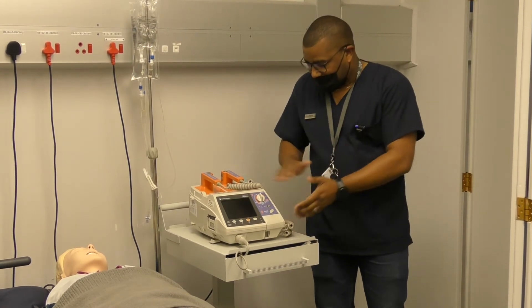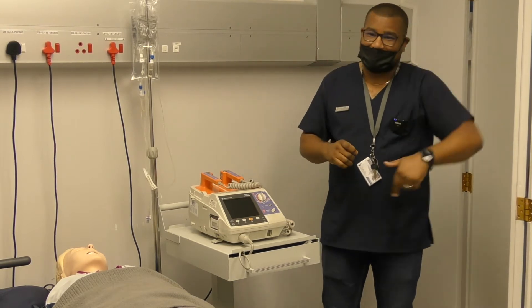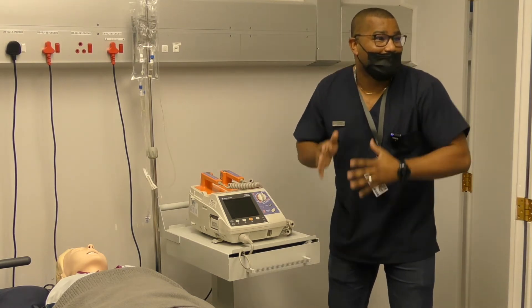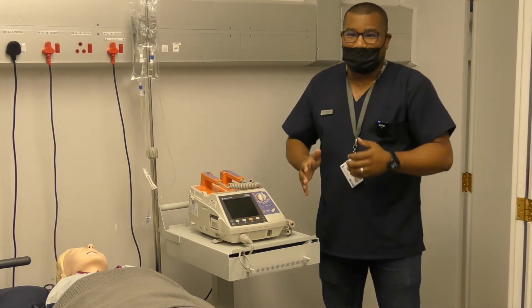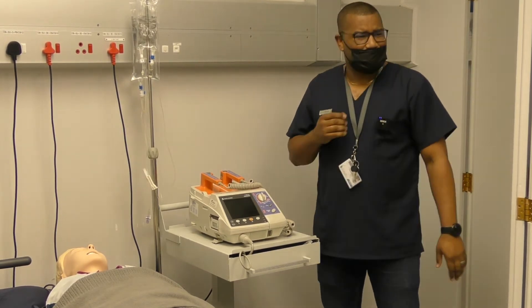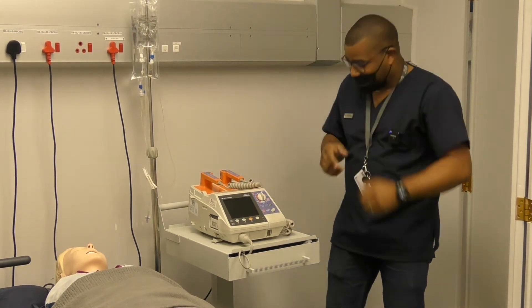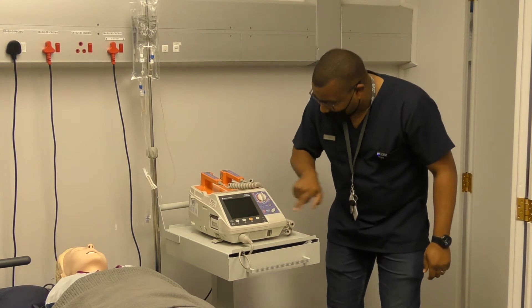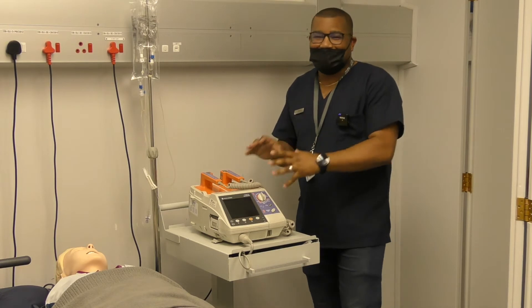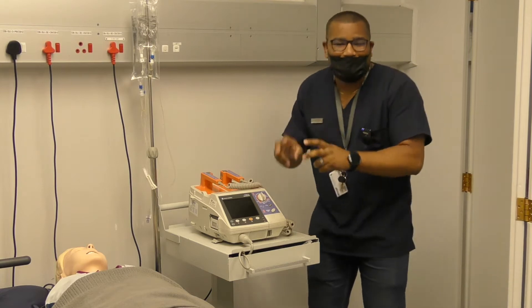In previous OSCEs, as I was doing compressions I would count one, two, three — and you would look at me wondering how I was doing compressions that way. What I was trying to guide you to understand is that it's step one, two, three — it's foolproof. You follow the steps one, two, three and that makes it much easier for you to operate the machine.